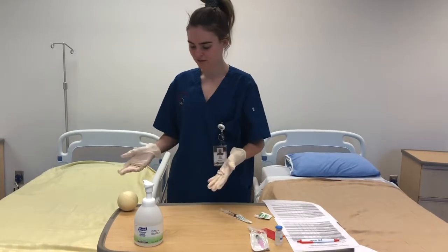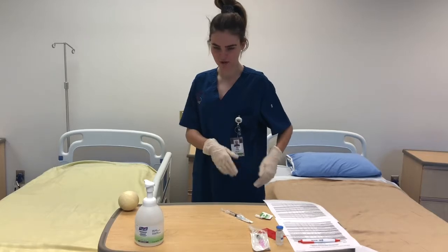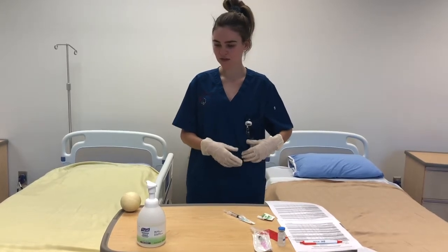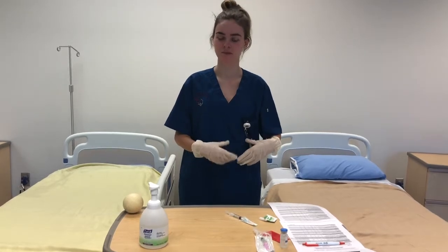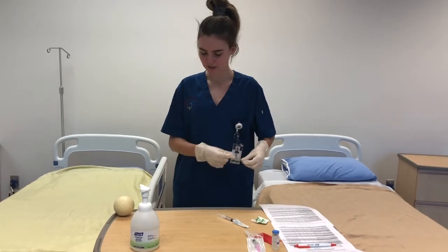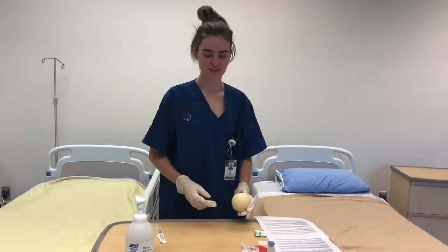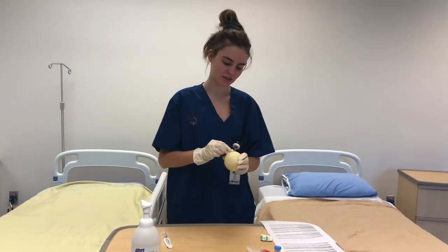So now, Mr. Mancini, I'm going to be doing a subcutaneous injection just in your abdomen below the waist but above the hip in this area along the umbilicus. And so there's multiple injection sites, but Mr. Mancini has chosen this particular site. So Mr. Mancini, I'm going to be pinching your skin a little bit and inserting the needle to give you your heparin dose. Okay, so Mr. Mancini, I will be injecting your heparin subcutaneously now, and I will be cleaning the injection site.